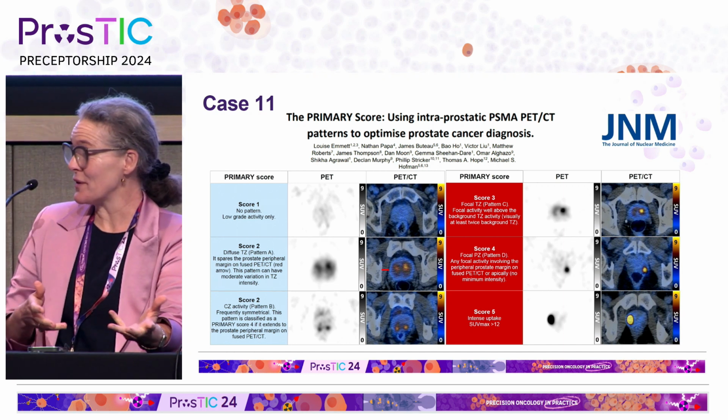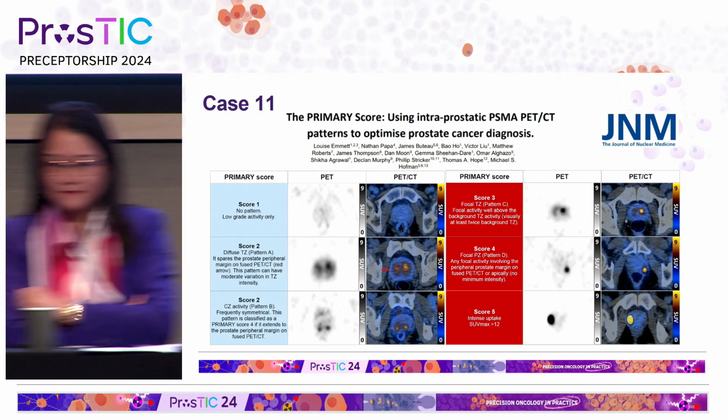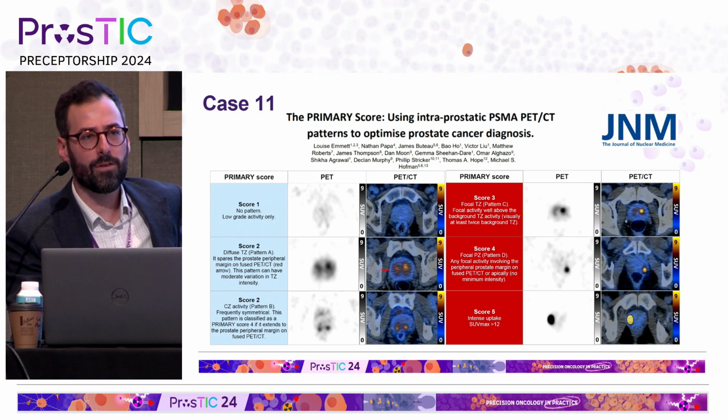Yeah, so you want to go through the scores? Yeah, so we're just going to have a chat about the scores. I think we started talking about this when you were down for the preceptorship 2 years ago. Yep. So it was 2 years ago, and SUV max is not everything.